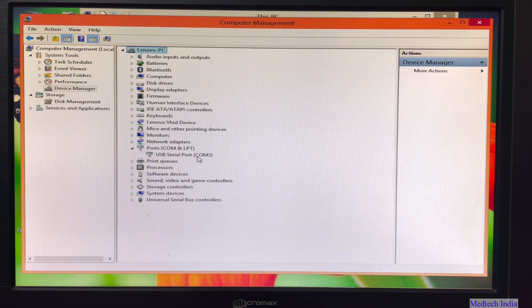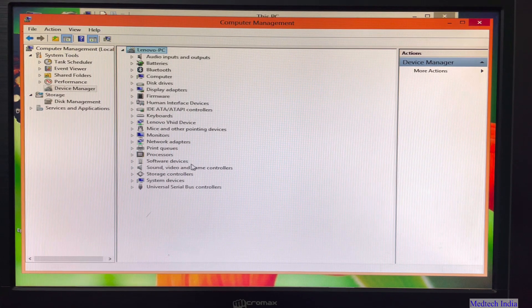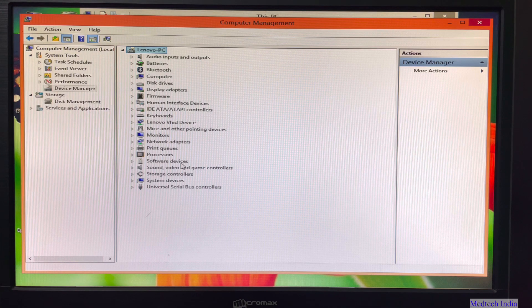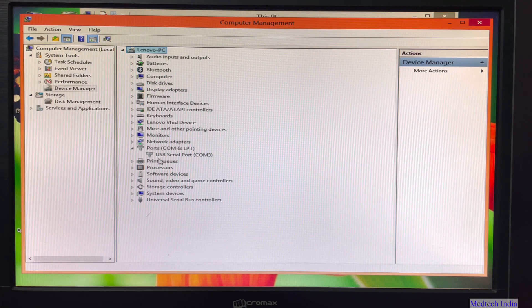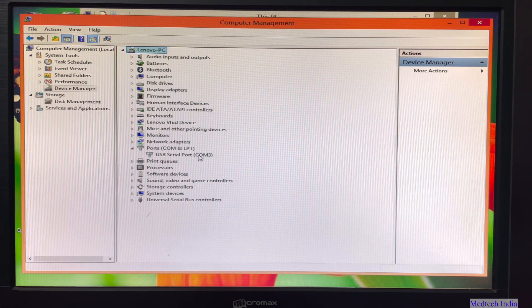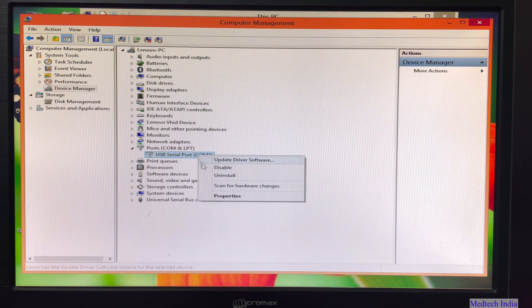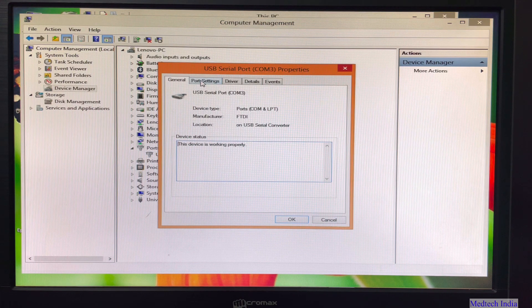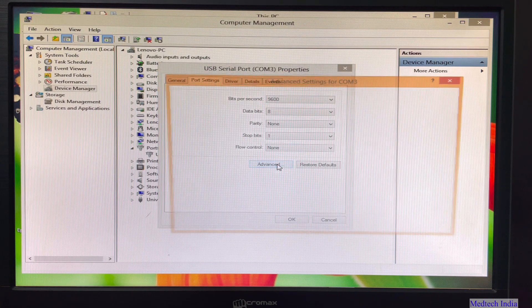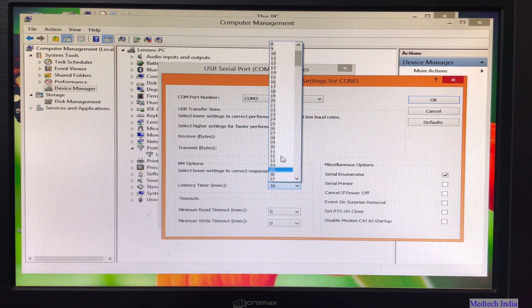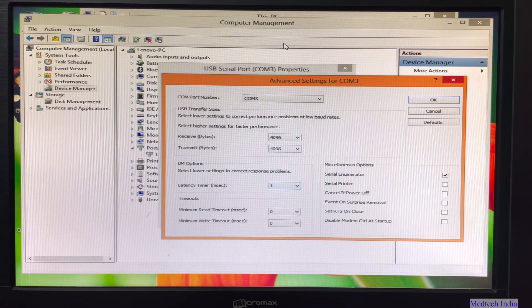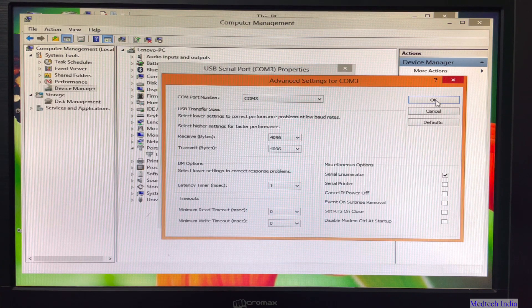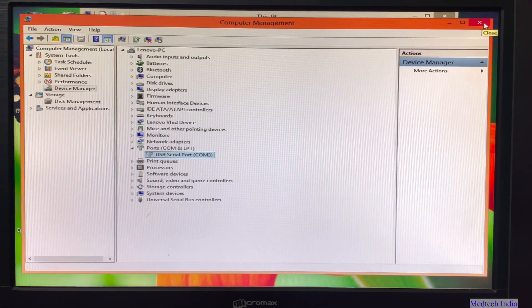So after clicking on that icon, you will get that USB port. If you are using multiple devices on the same system, then COM port can be confirmed by removing and plug in the USB cable again. In our system, the COM port is 3. It can be different in your system. Now right click on COM 3. Then go to properties. Then go to port settings. Then advanced. Then change latency from 16 to 1. Then click on OK. Then one by one close all open windows.